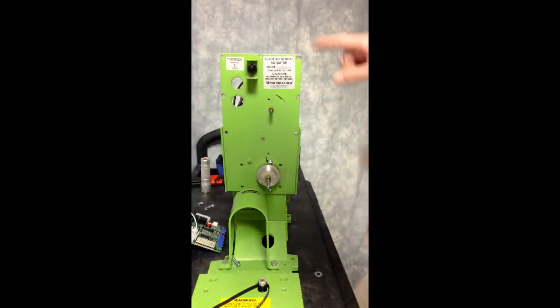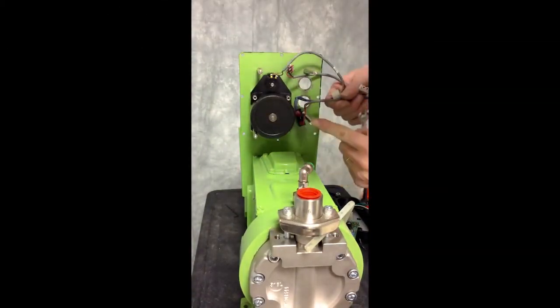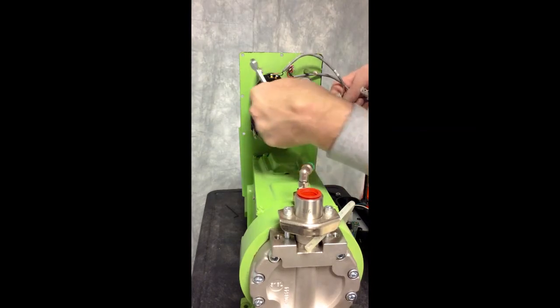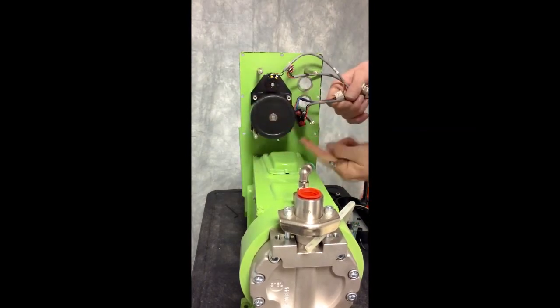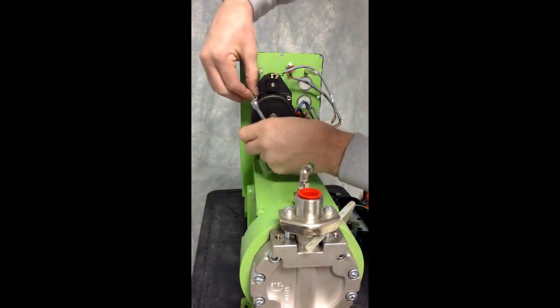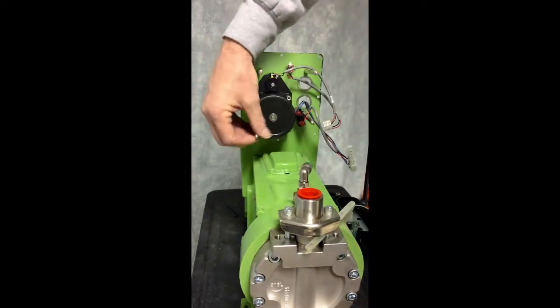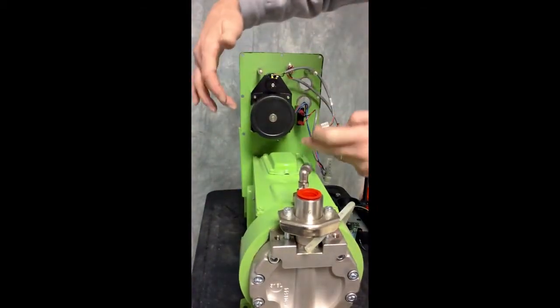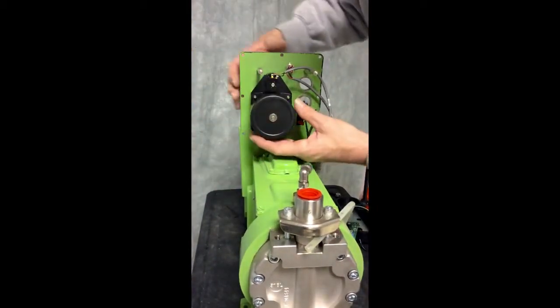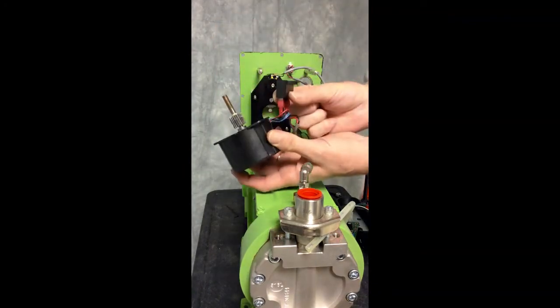Now you are ready to remove the motor. Using a 1/4 inch wrench, we are going to remove the five standoffs which are holding the motor and capacitor in place. With the standoffs removed, you are now free to remove the motor and the capacitor from the pump.